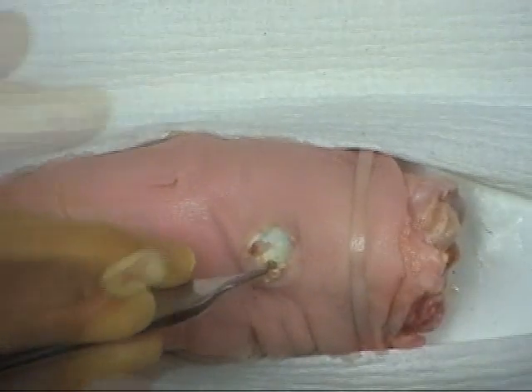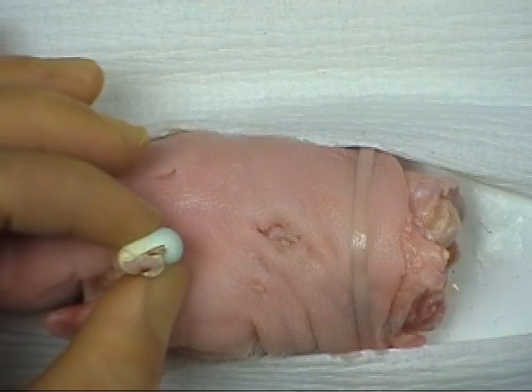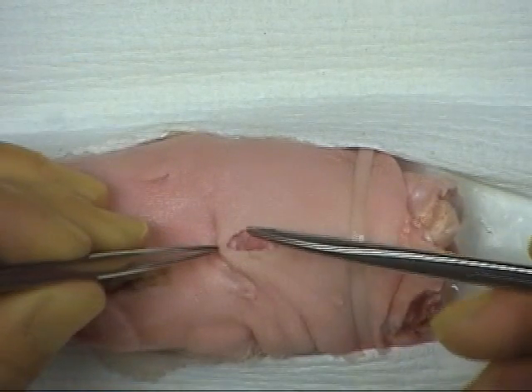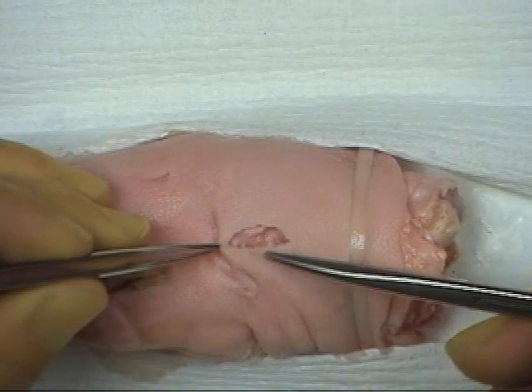The cyst is then removed together with the overlying skin ellipse and punctum. The elliptical wound must then be closed using interrupted sutures, starting at either end and working towards the centre.